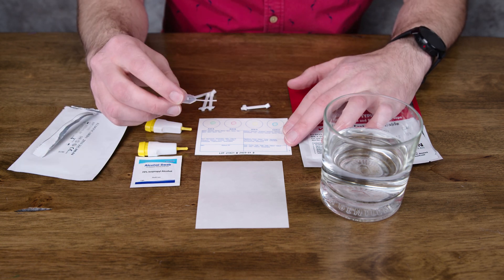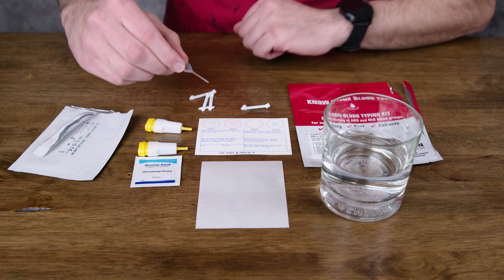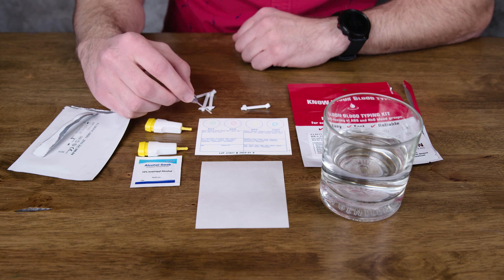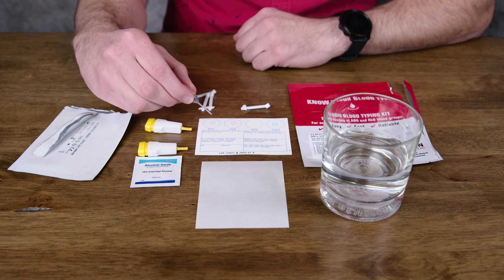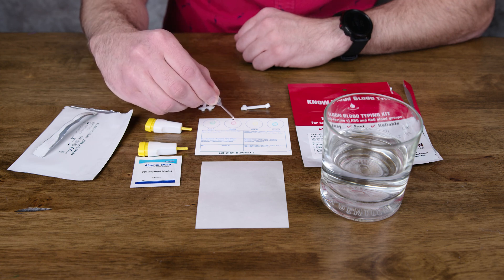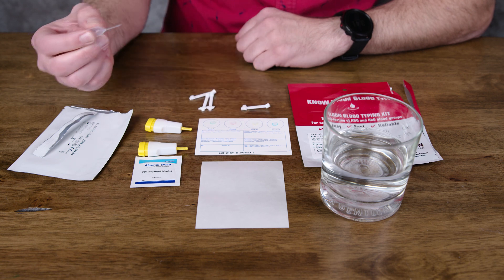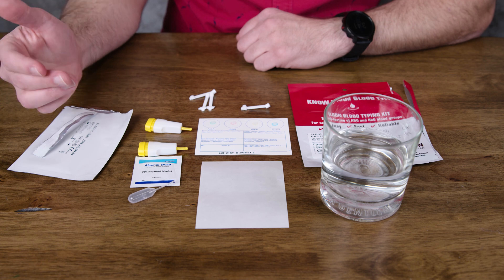Let's start by activating our Eldon card. Take the pipette, get some water, and then let drops of water fall into that little colored circle. Let the drops fall — do not touch the pipette against the Eldon card, because then you can cross-contaminate your antigens. I'm going to squeeze two drops into that little circle. Now we have activated our Eldon card and it is ready for blood.